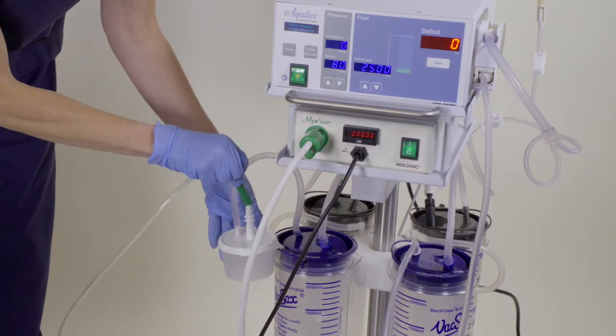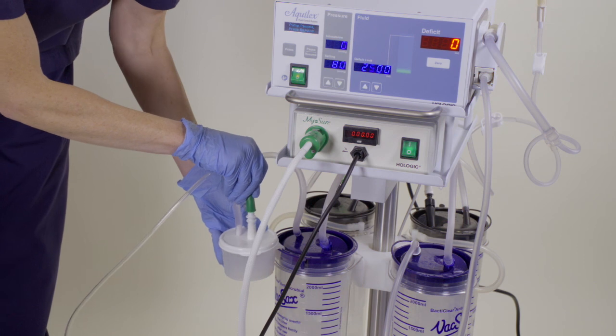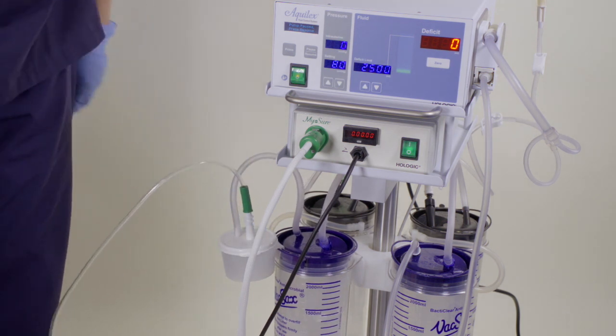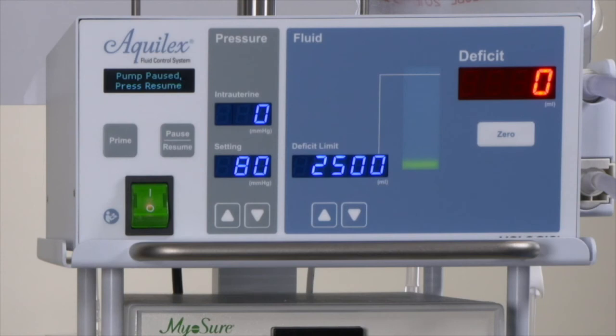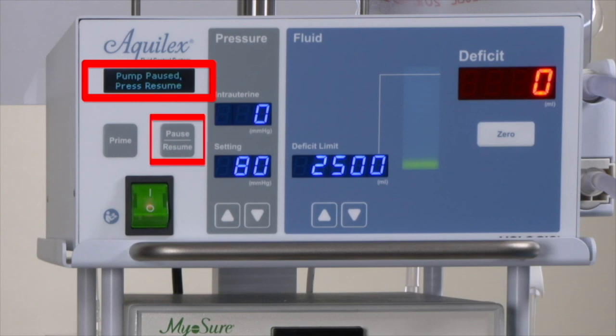Next, connect the tubing from the MyoSure device, which has a green tip, to the tissue trap port. Note, due to the sensitivity of the Aquilex scales, the system will automatically pause when any pressure is applied to the canisters. An audible sound will be heard and the message screen will say, "Pump paused," when this occurs. Ensure you press the pause resume button to start the fluid flow again when the clinician is ready.